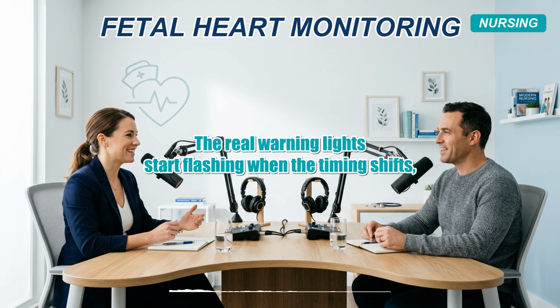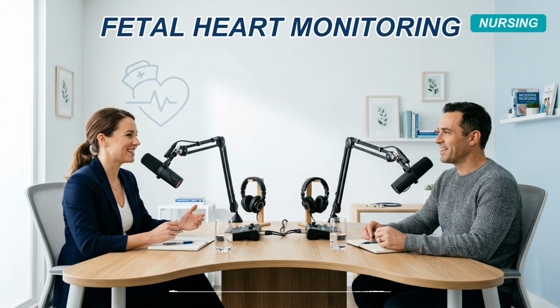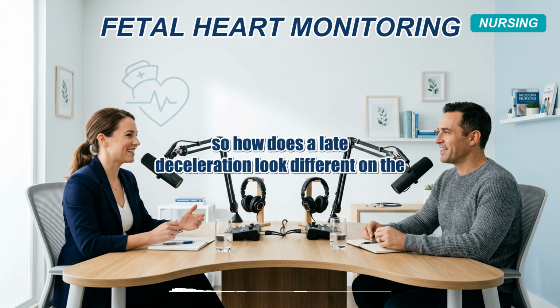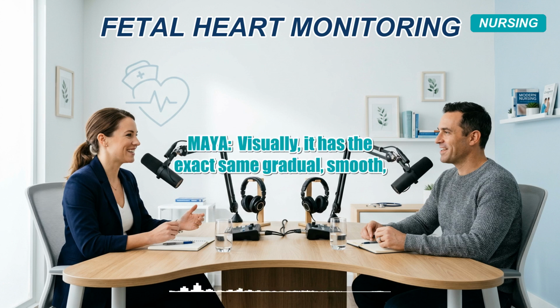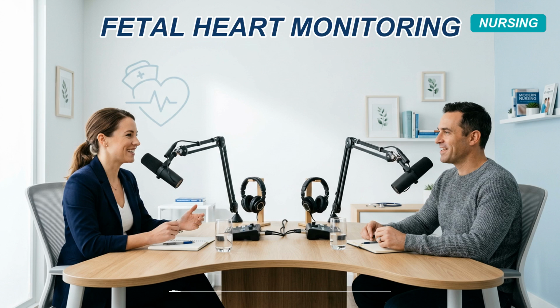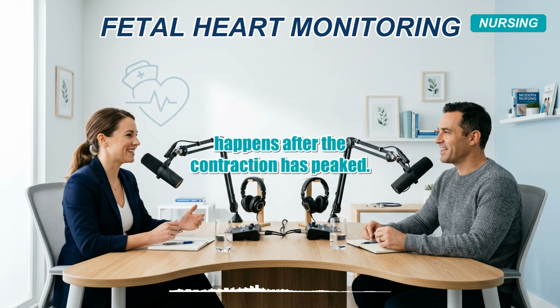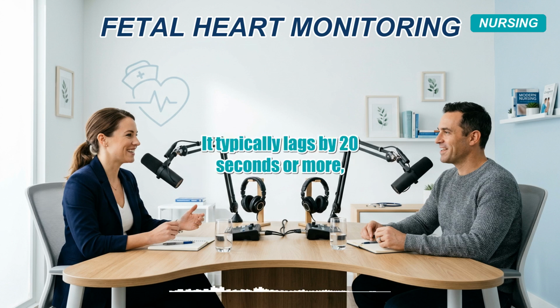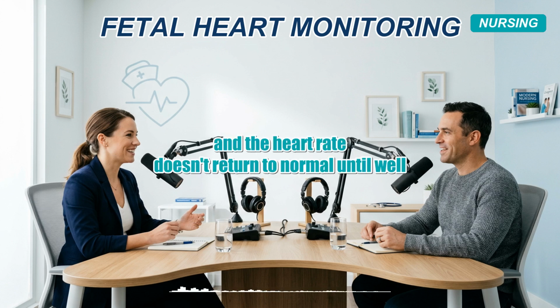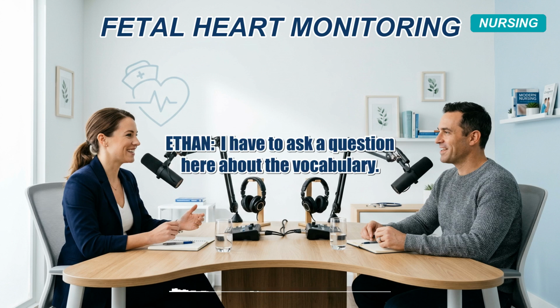The real warning lights start flashing when the timing shifts, which brings us to late decelerations. Okay, so how does a late deceleration look different on the screen? Visually, it has the exact same gradual, smooth, rolling hill shape as an early deceleration. The difference is entirely in the timing. So it's shifted. Yes. The nadir, the lowest point of the heart rate, happens after the contraction has peaked. It typically lags by 20 seconds or more, and the heart rate doesn't return to normal until well after the contraction is completely over.